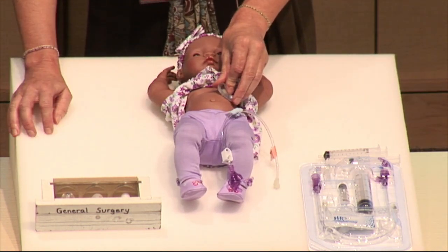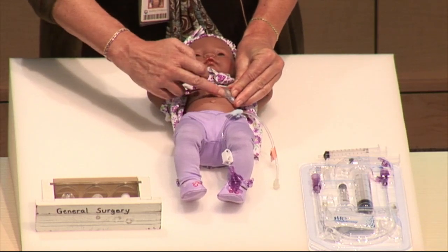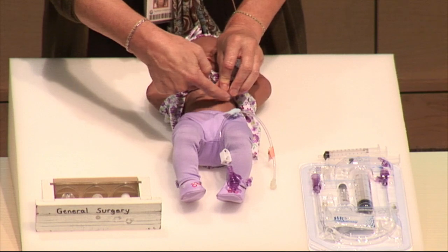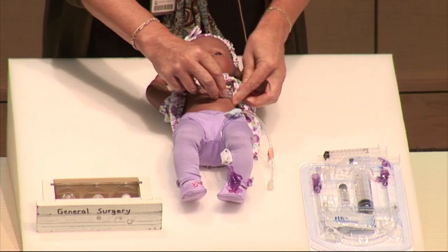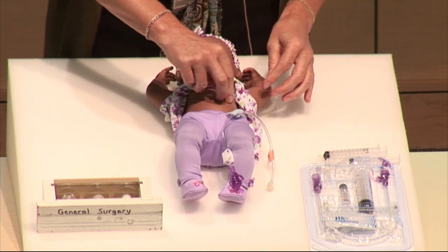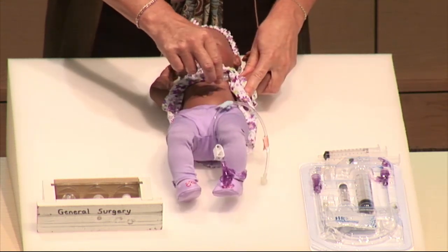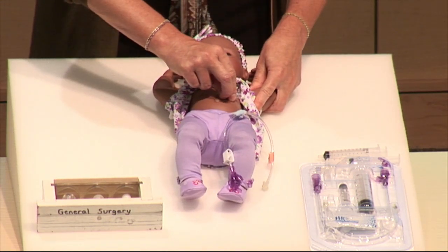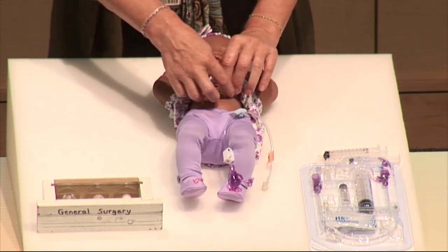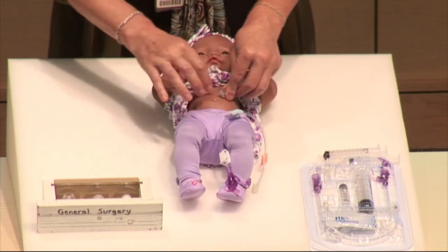So I show them that you can pick up the tube and put it to the side a little bit so that you can clean all around underneath and get all those crusty goopies off. It's okay to handle it like that. Everyday handling is not going to make the tube fall out. You'd have to pull it hard to make it pull out, but you can clean all around it, pick it up, move it around.